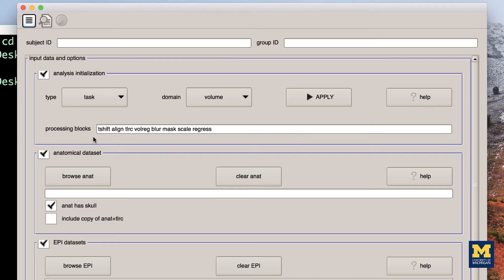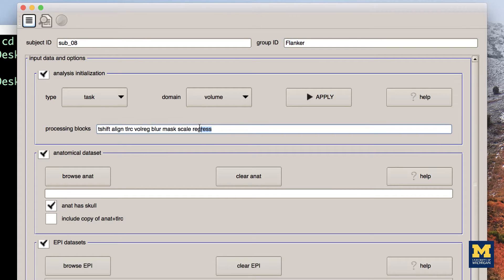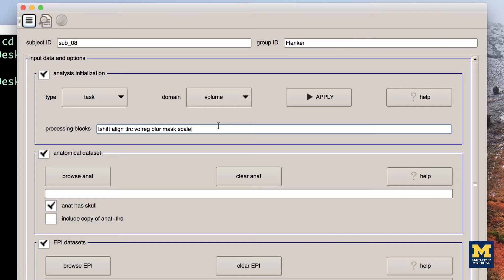Now, let's set up our preprocessing script. In the Subject ID field, type sub underscore 08, and in the Group ID field, type Flanker. Click on the box next to Analysis Initialization and remove the Regress block. We'll include this later when we run a general linear model for each subject.